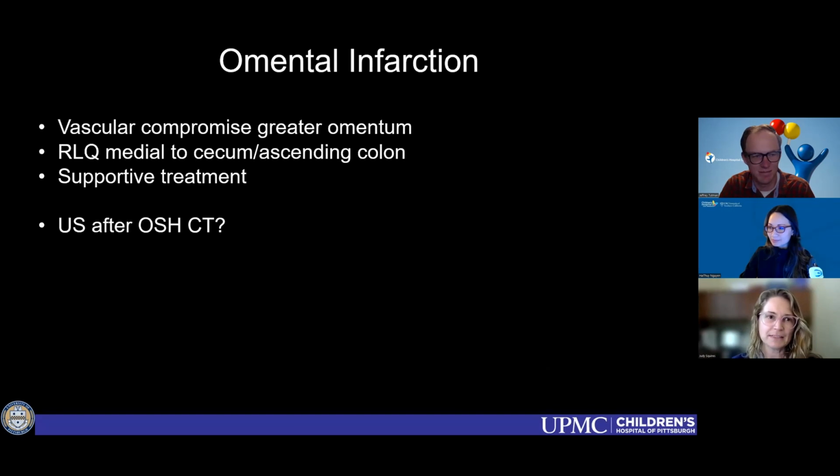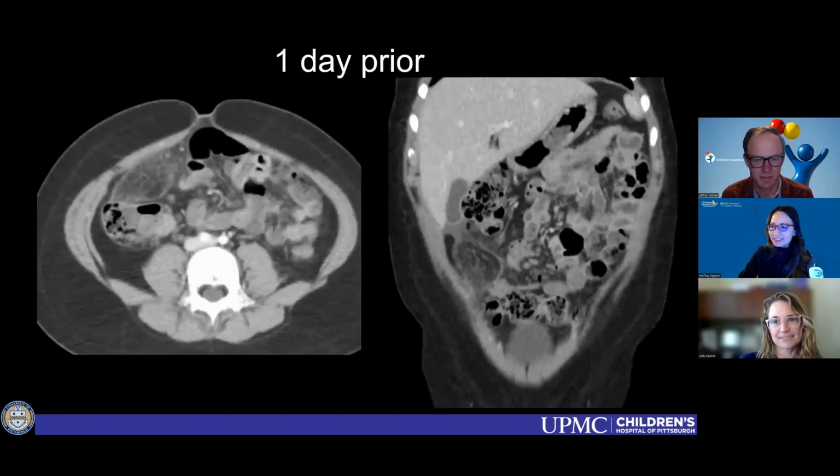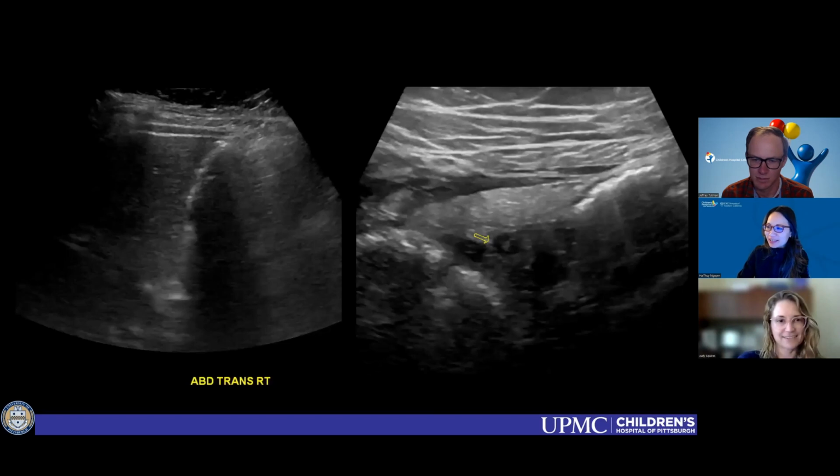So, you already covered all of this. No, but actually from that image that you showed, on the ultrasound, without the stitching, without everything, would you be confident to say that that's not appendicitis? Because it's almost like the appendix and then all this inflamed fat next to it.